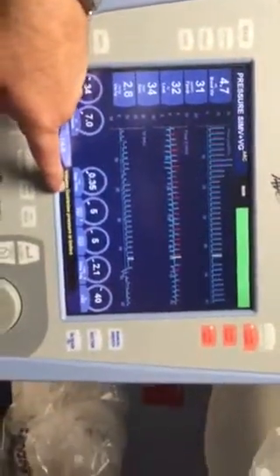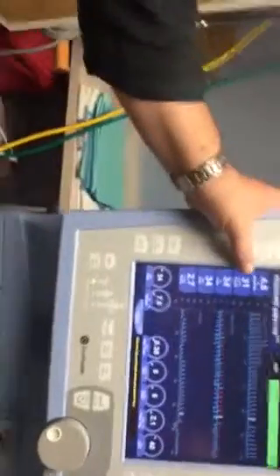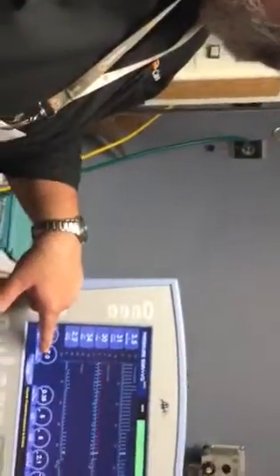At that point, you're going to get this that comes up. Volume guarantee pressure is limited. So my peak pressure is 31. I'm not going to go past 31, but I'm still not even close to my 7 cc's. So the question I have to ask now as a clinician is, which is more important to me? Keeping my 7 cc's or keeping my safe high pressure limit? That peak pressure is so high for babies, isn't it?